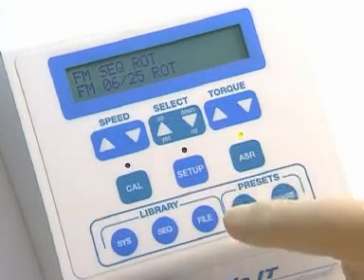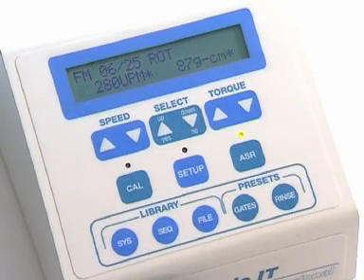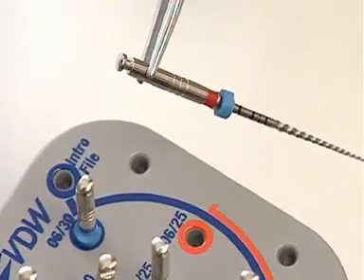The next file is the 0625, the first in the red sequence. It is selected with the down key. This file is located in the first position of the red sequence in the system box.